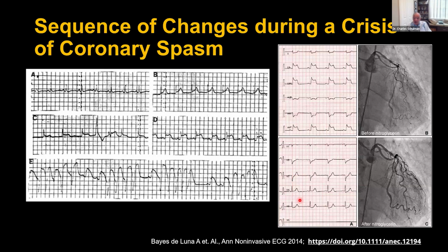And this is an angiogram during vasospasm, and then after nitroglycerin, showing relief of the vasospasm. So that is not acute injury or infarction.